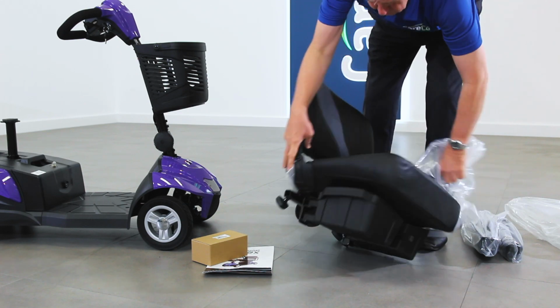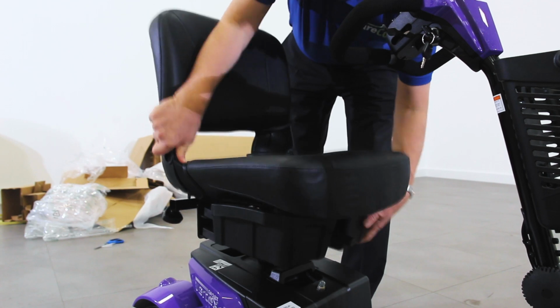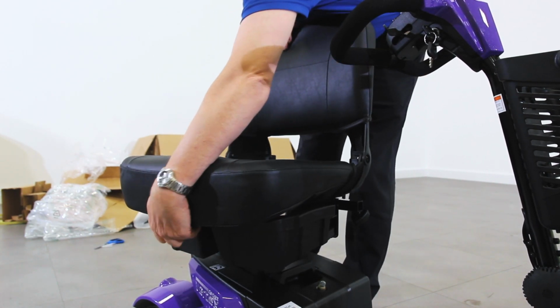Now it's time to add the padded seat. With the rubber stop removed, drop the seat onto the post. You can then use the lever underneath to swivel the seat from side to side.